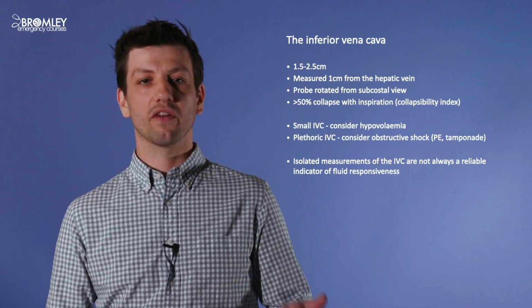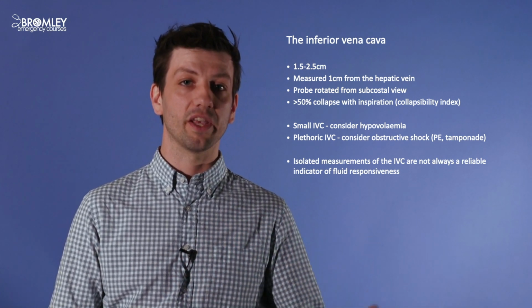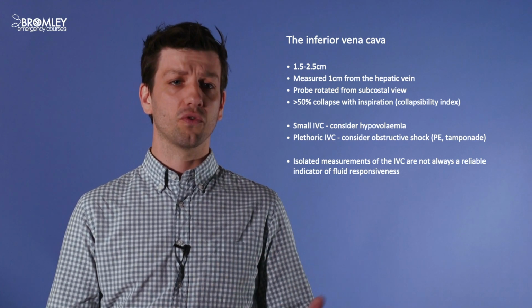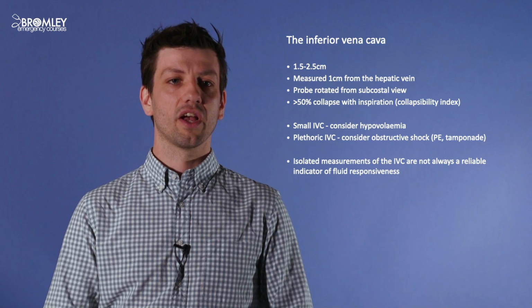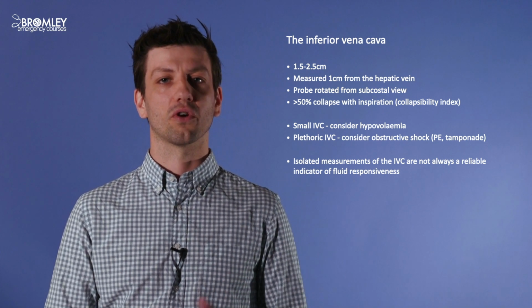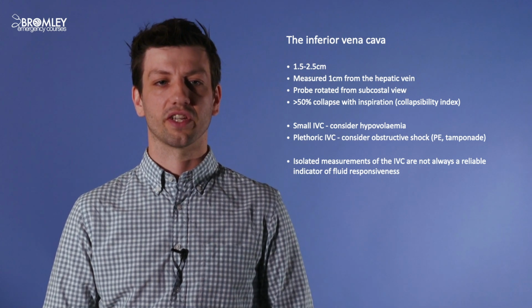When we see a small IVC, we need to consider hypovolemia as a reversible cause of cardiac arrest. And as we've mentioned before, if we see a big plethoric, non-collapsing IVC, we need to consider whether a PE or cardiac tamponade has caused this patient's arrest.